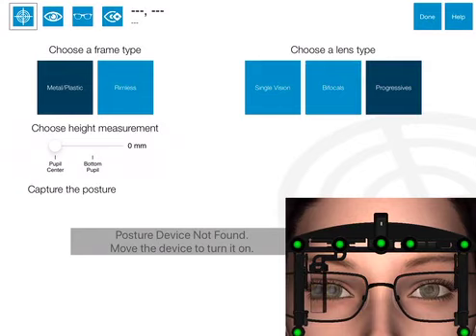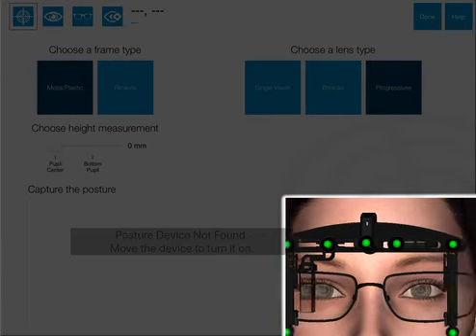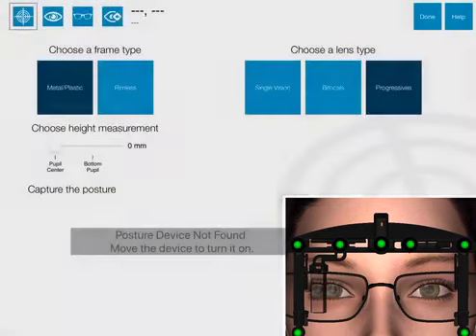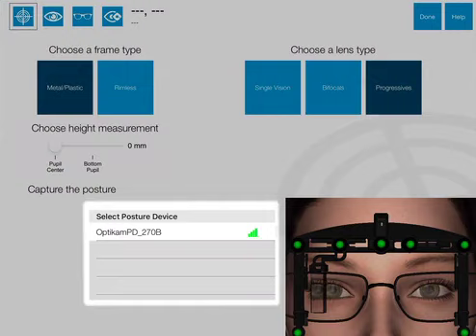Ensure that the OPD indicator light is blinking blue. If it's not, simply wake up the OPD by asking the client to move their head. If the OPD quickly blinks red on motion or doesn't blink at all, it will need to be charged prior to use. Once the OPD indicator light is blinking blue, proceed by selecting it in the device list.